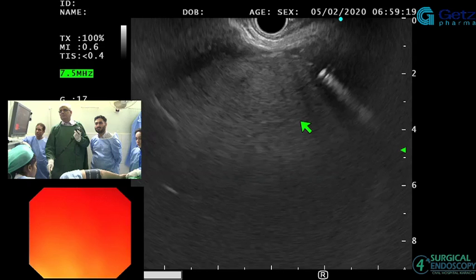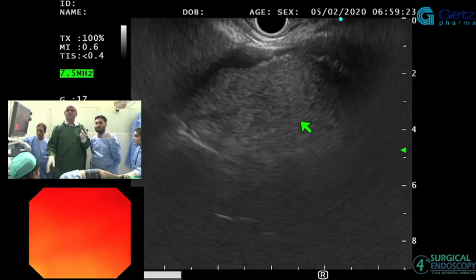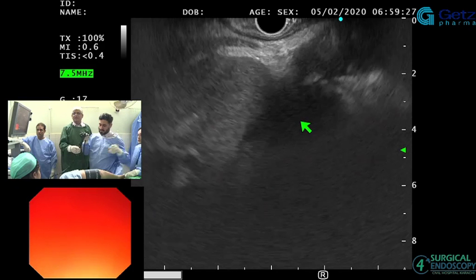Liver, I couldn't see any. You saw the liver thing. Just have a look at the mediastinum and we'll come out. I think the area of interest here we've seen.